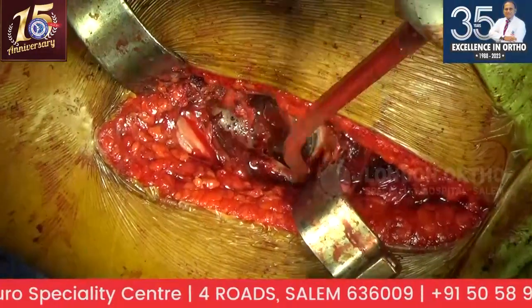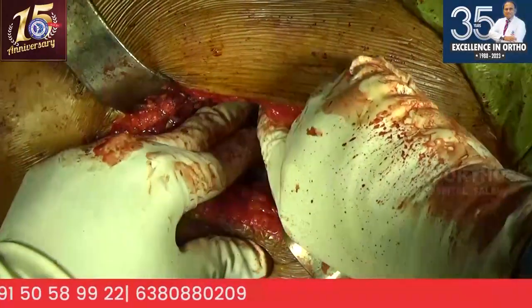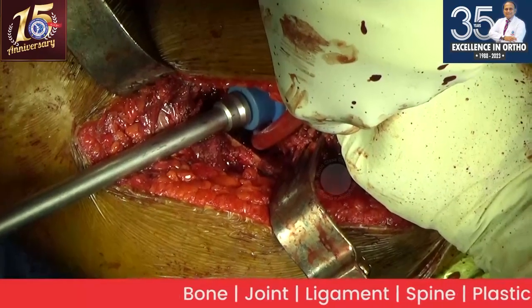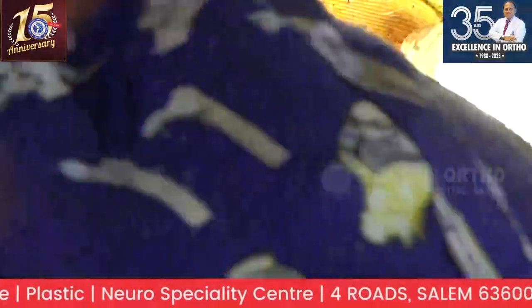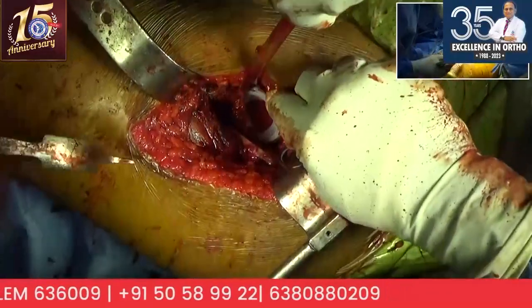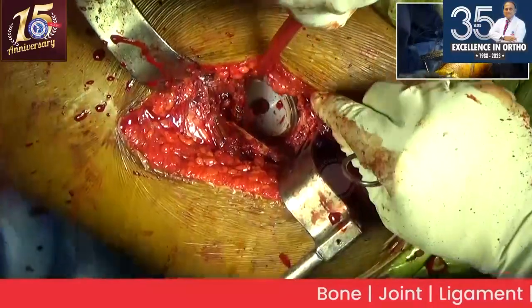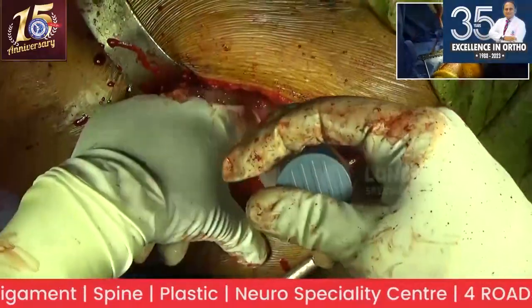Good. Okay, we're going for a liner. So it's a neutral liner? It's a neutral liner, yes. Good, all soft tissues are completely gone. Now hit it. Yes, hit it. No, good. Okay, so that's seated well. So that will take a 32 head, ceramic.